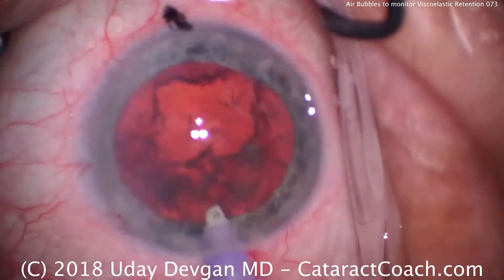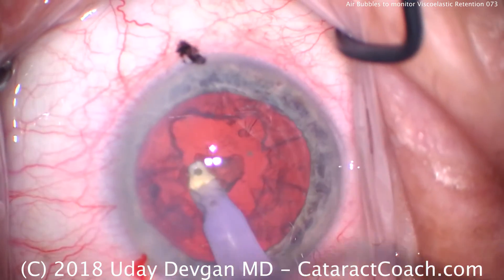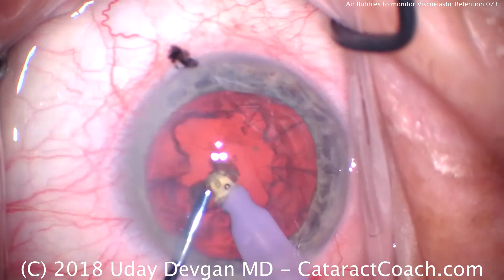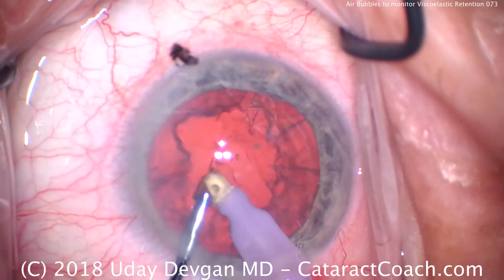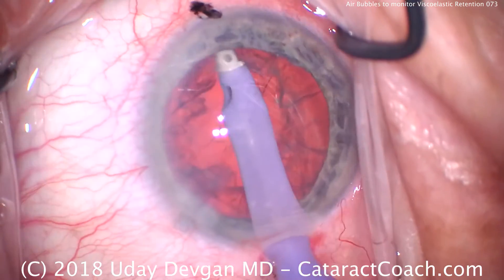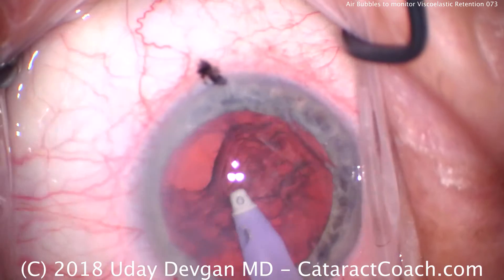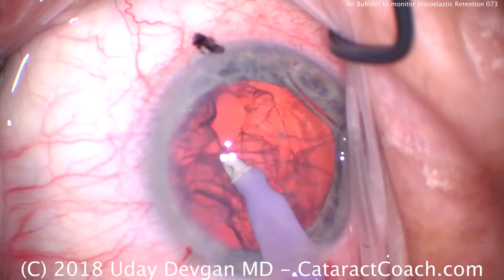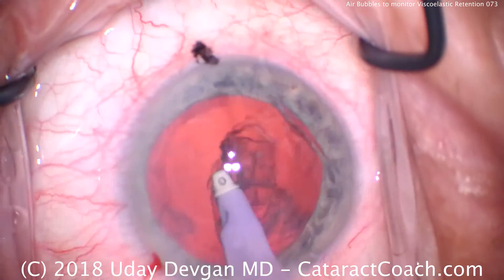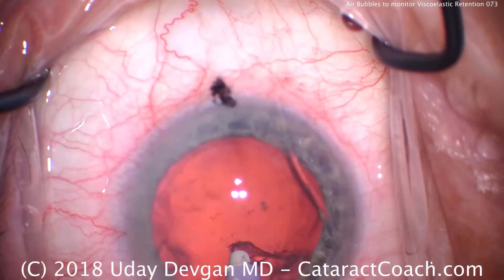We're showing the video unedited and in real time to give you an idea of the entire case. Here comes the I/A probe, removing our cortex and any epinuclear pieces. We can use a spatula or other instrument to help push material into the aspiration port. If you watch my videos, you know I like a circumferential approach — grabbing at least a couple of clock hours at once and then pulling centrally, going around 360 degrees including subincisional. Look carefully at the presence of bubbles; we can still see they are present.